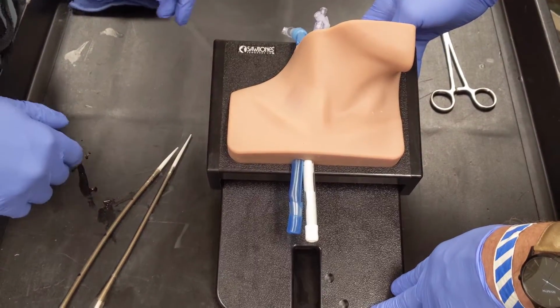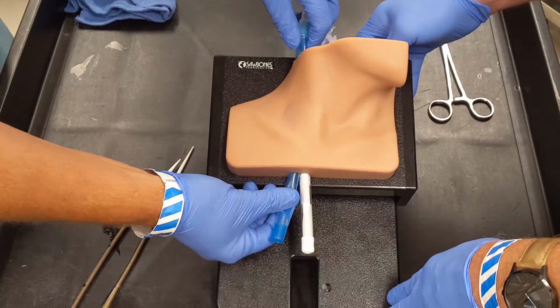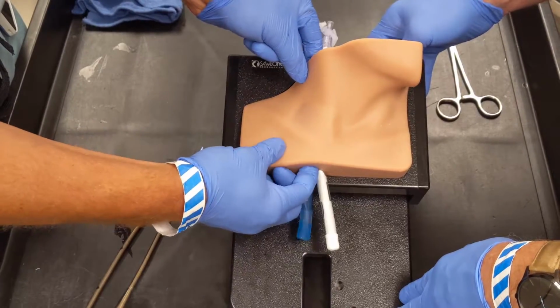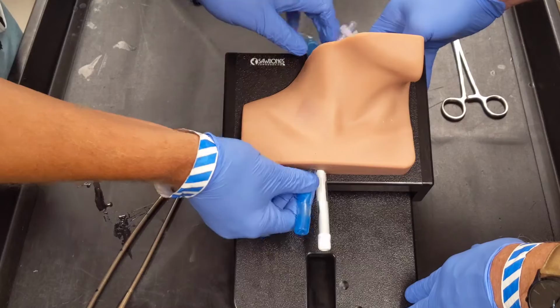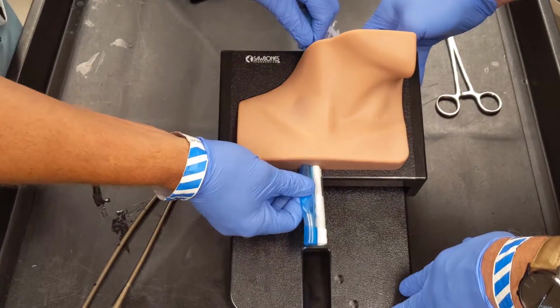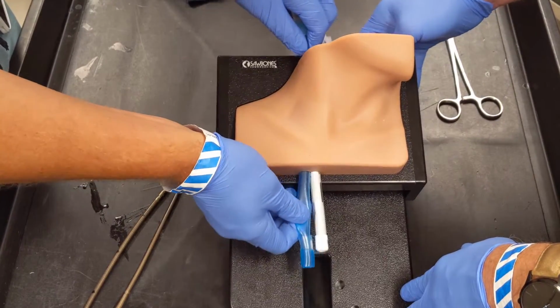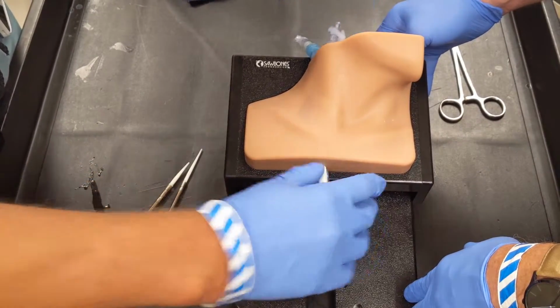Okay, now we're going to show how to connect the neck and vessels to the heart. So a little tip on moving the vessels: we have a Surgilube or lubricating jelly inside here, and that helps it slide. You want a little bit of slack forward initially, and so you can pull both ends, and it'll kind of release it, and then you move it around.